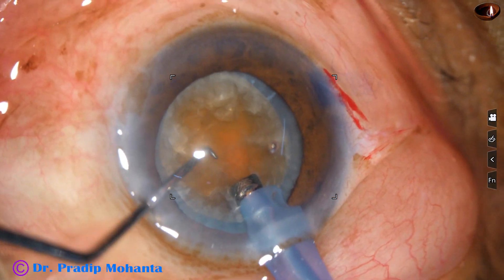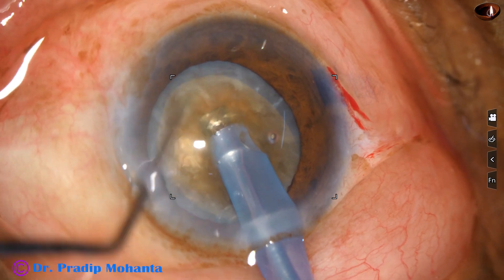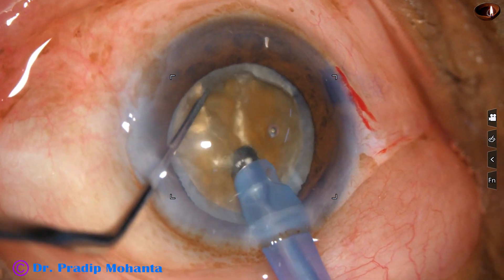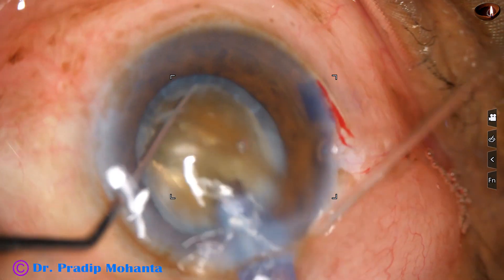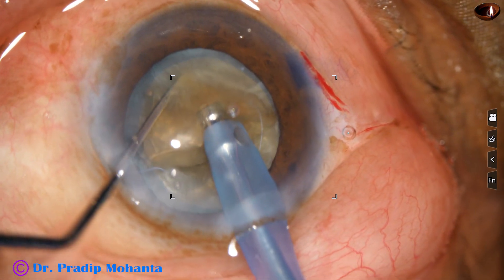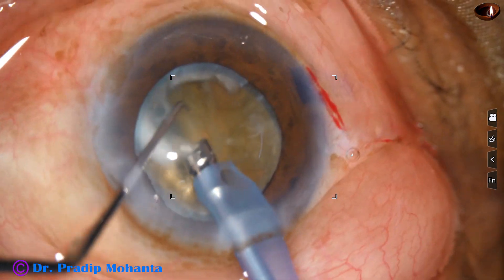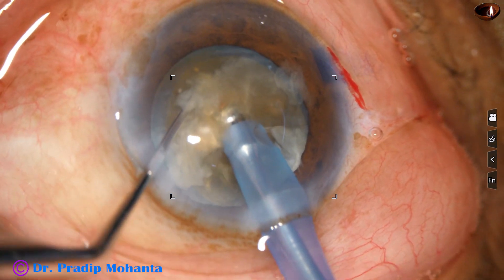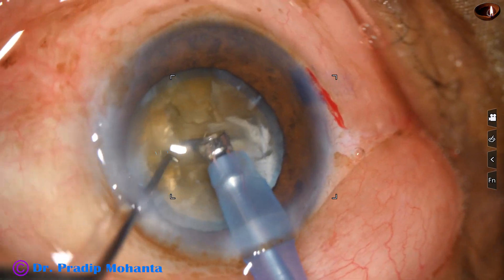This kind of nucleus doesn't want to get cracked. So this is the first chop. We can see the white cortex on the other side of the nucleus. It is rotated 180 degrees and the nucleus is divided into two pieces. This heminucleus is quite large — larger than the other heminucleus. And I find that the fibers are resisting being divided; the pieces, though separated at the periphery near the equator, are still joined to each other at the center.